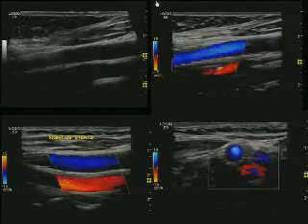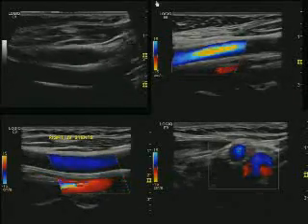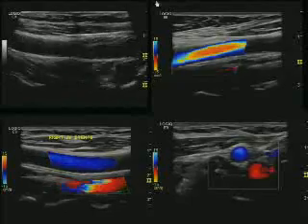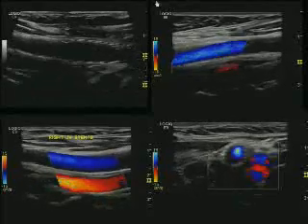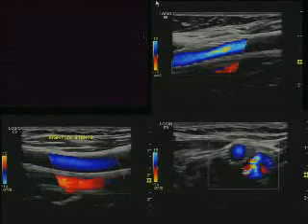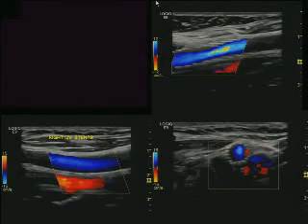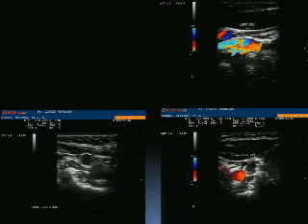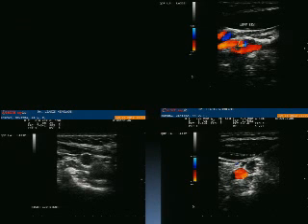There is a very small hyperplasia here without stenosis. The result is, as you can see, amazing. It's fantastic. And the same patient is here, and you can see on the cross-sectional area the other side with total occlusion of the left internal jugular vein.